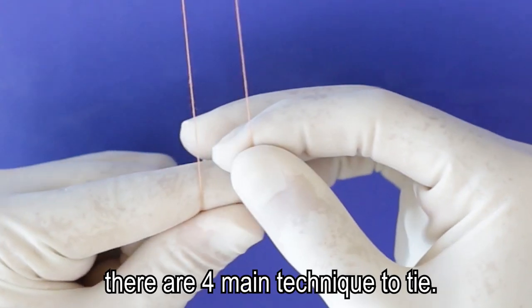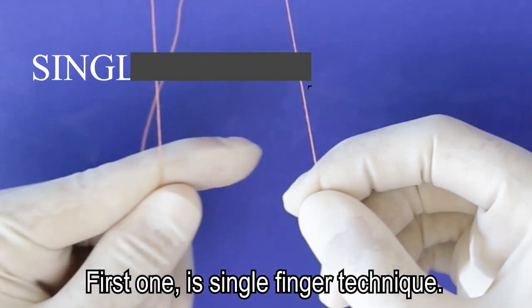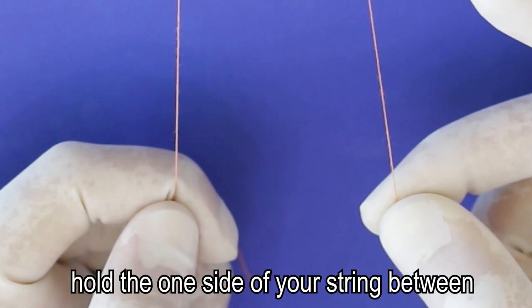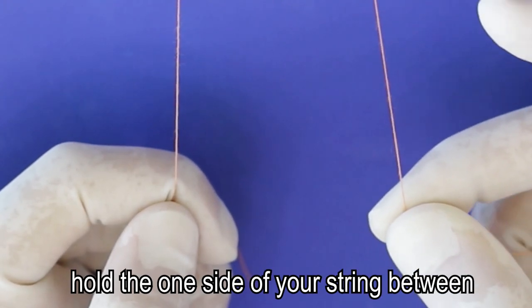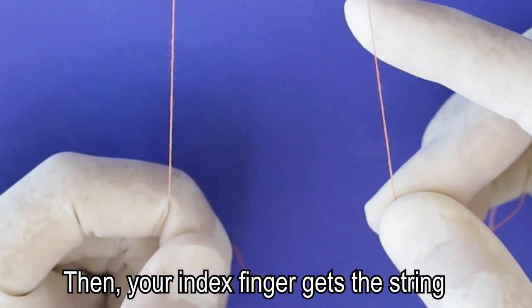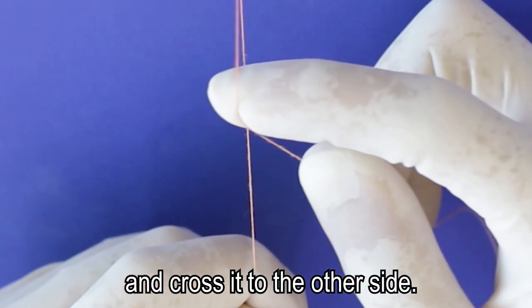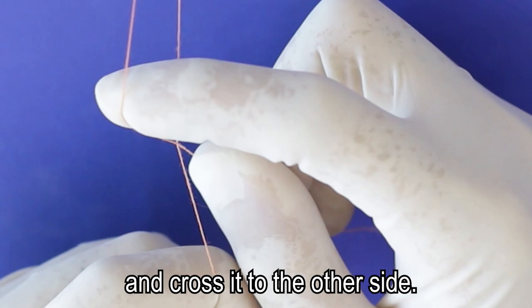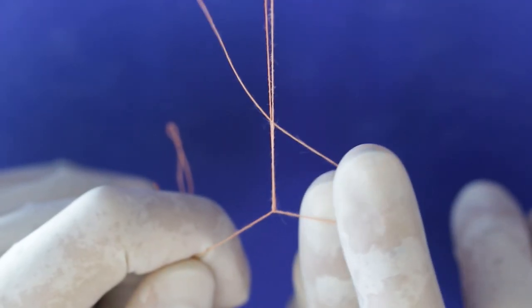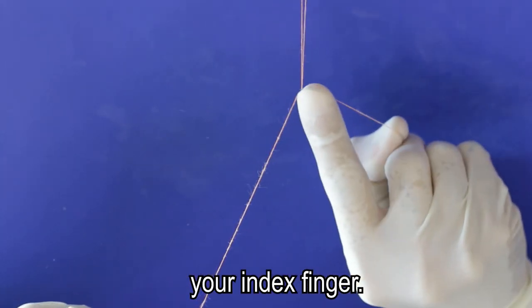Essentially, there are four main techniques to tie. First one is the single finger technique. In this technique, you need to hold one side of the string between your thumb and middle finger. Then your index finger gets the string and crosses it to the other side. Then follow your knot with your index finger.